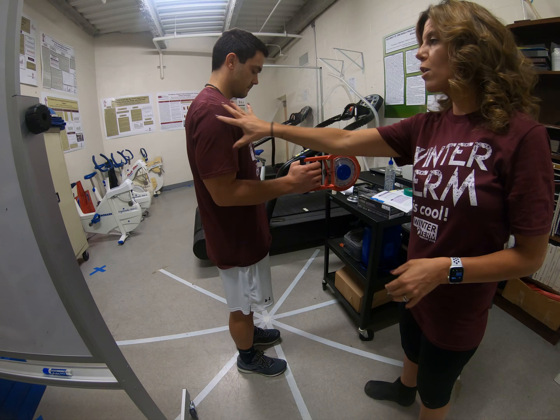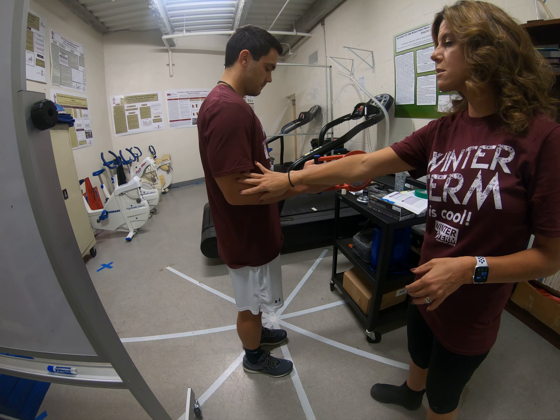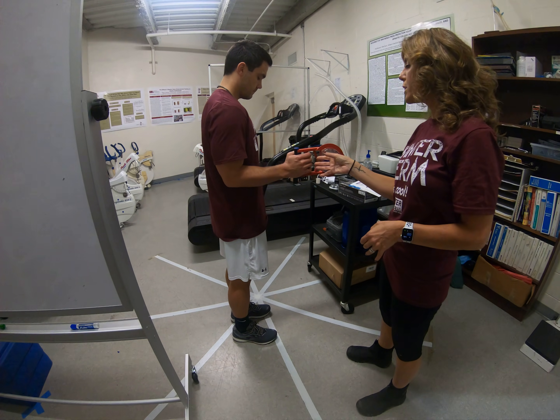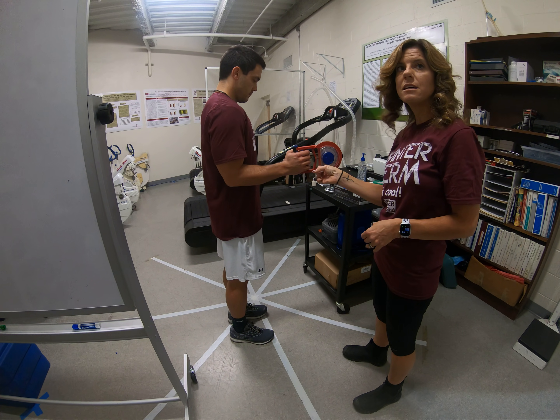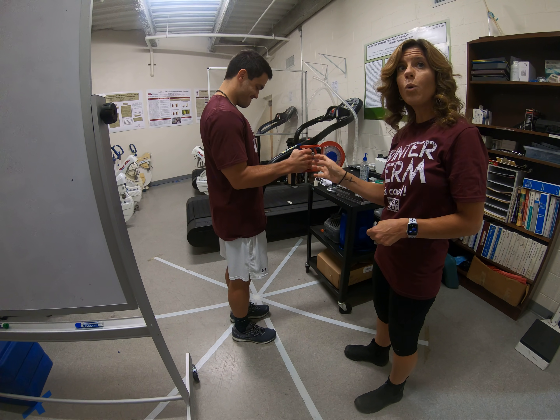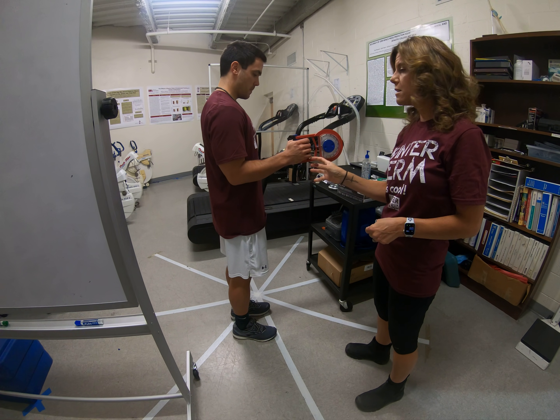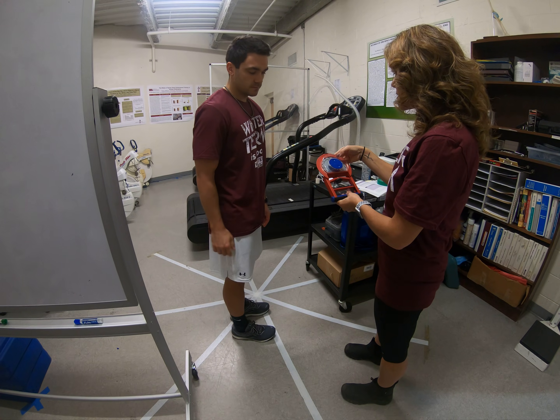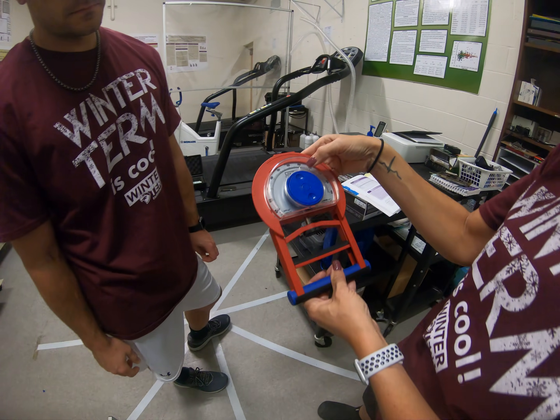Make sure that their arm is at a 90 degree angle and it's as close to the body as possible, and tell them to squeeze as hard as they can without holding their breath. Make sure that they're exhaling through the motion and then take the measurement down in kilograms.